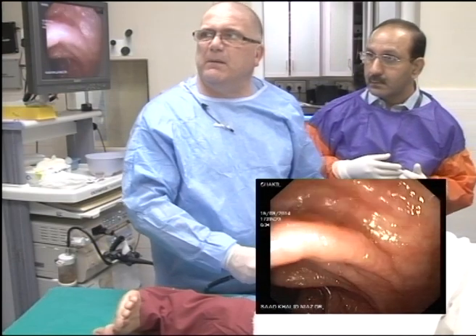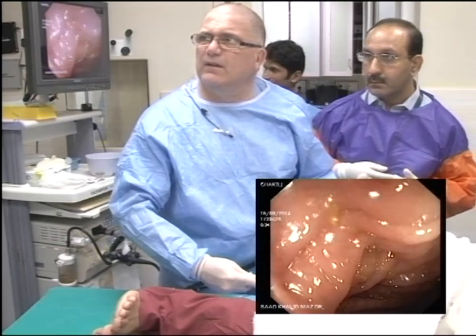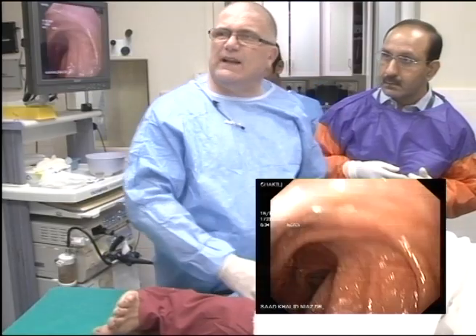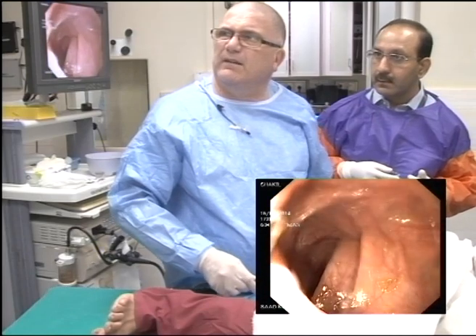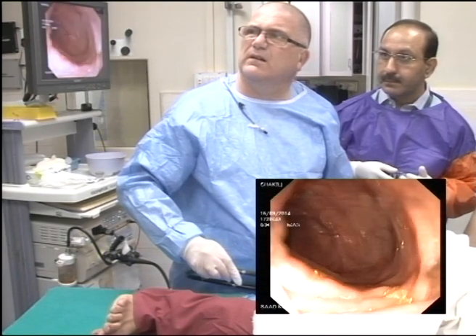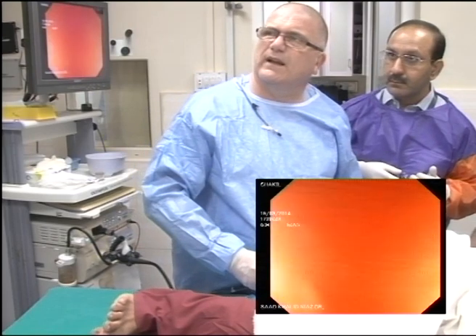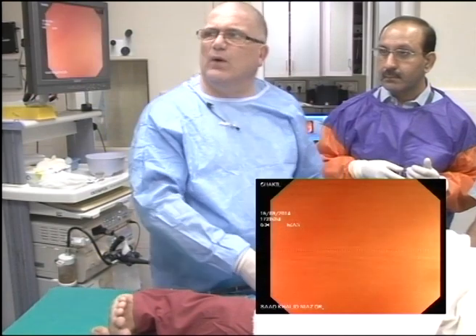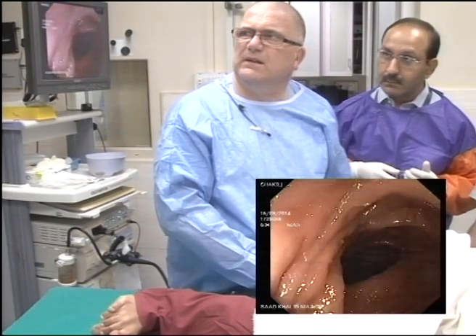Now he'll start to feel a little bit better, and if you watch, I'll take the scope back, keep it there, suck down a little bit more, and now go forward. And it's because of the air that's gone in. You just sat on the button and filled him full of air. Okay? So now we just want to come back. Come back. And now go forward again. Water is what we want, not the air. Water is what we want, not the air. Okay?